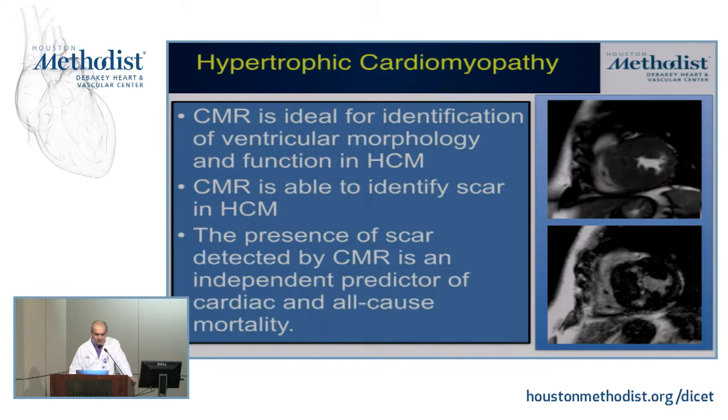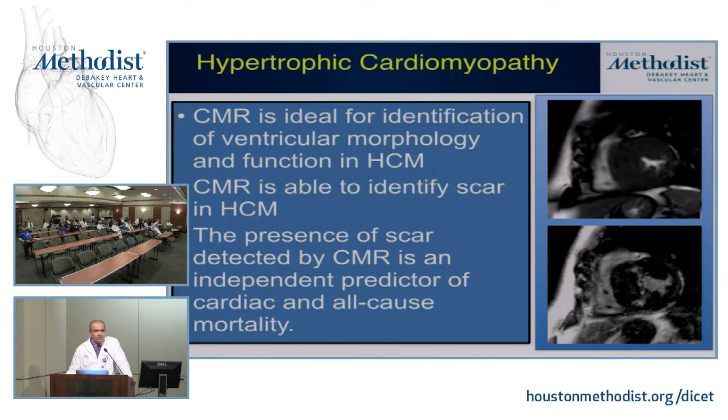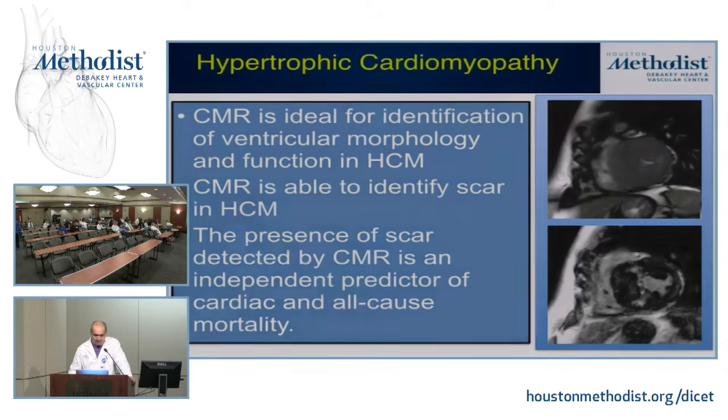Let me skip this. Dipan, has this made prime time now? Because I think the U.S. guidelines still do not use these. The HOCM guidelines were last updated in 2011. The European guidelines do have it as one of the things that kind of help put you over, if you're on the borderline. For an ICD? To switch you over, right, yeah. But the U.S. guidelines, they're probably due for a HOCM guideline update at some point as well.